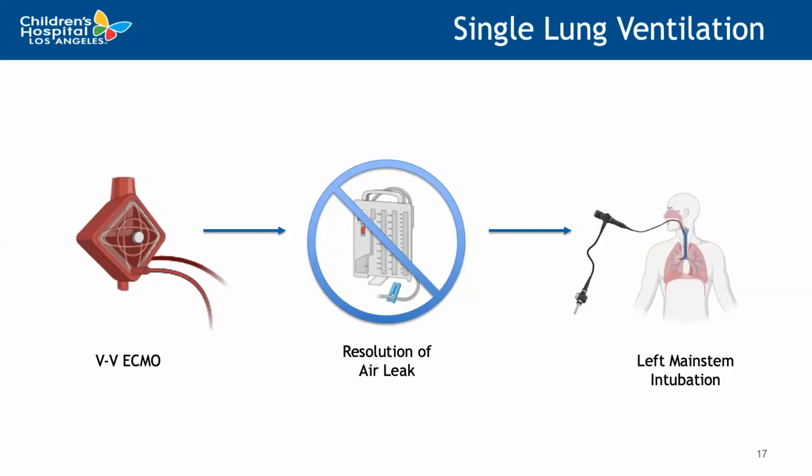So ultimately, the patient was selectively intubated while on ECMO. We had the ECMO circuit doing most of the oxygenation and ventilation, and so we were able to place, via bronchoscopy, the endotracheal tube into the left mainstem bronchus, allowing for full healing of the right side.